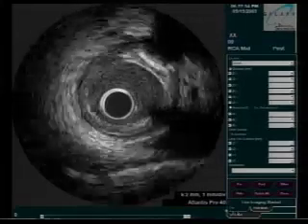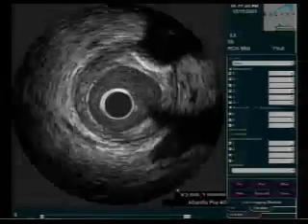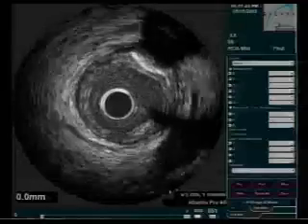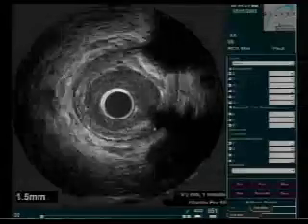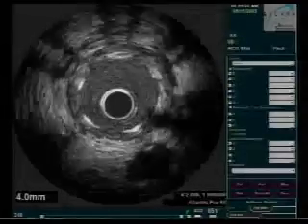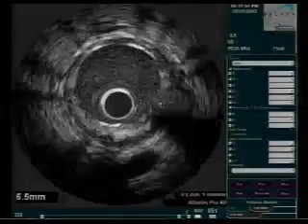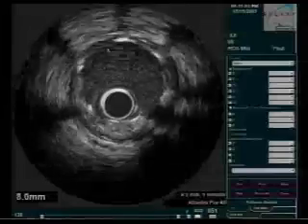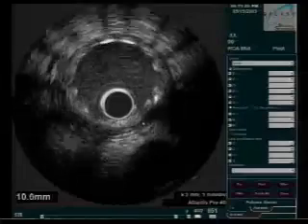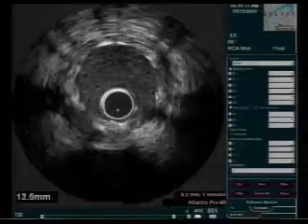Okay, now if we can go to the full screen IVUS, we'll see that we're now distal once again to the stent. We're going to start our pullback, and here we have some moderate disease distal to the area that we've stented. By distal you mean downstream. That's correct. And now coming into view are these bright bands of the stent surrounding the large lumen now and pushing this plaque back against the arterial wall. We continue to pull back and see the stent struts surrounding. We see this large lumen.